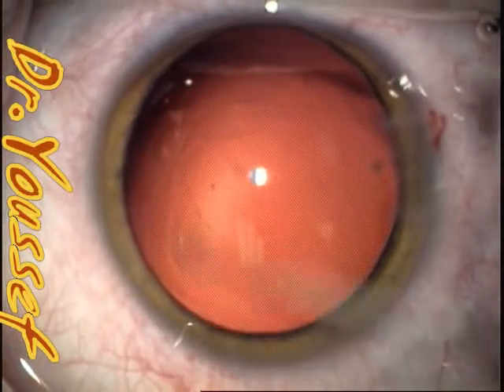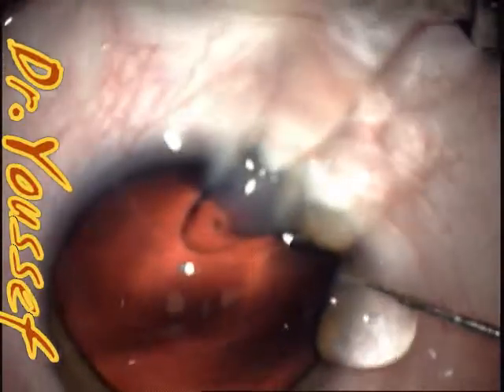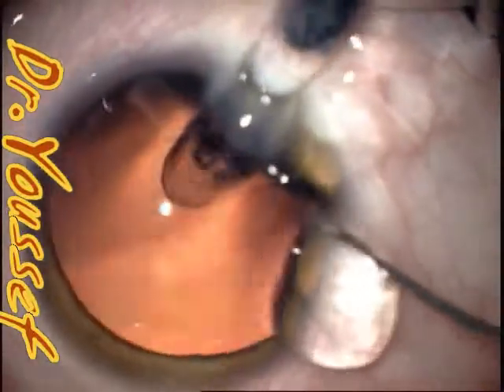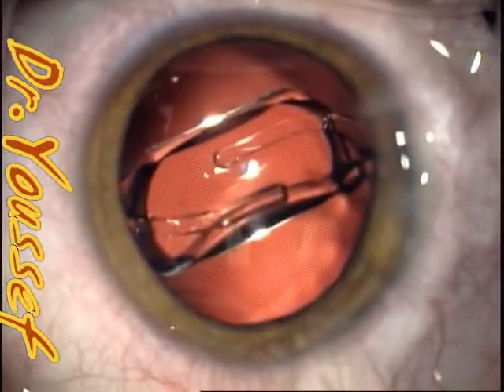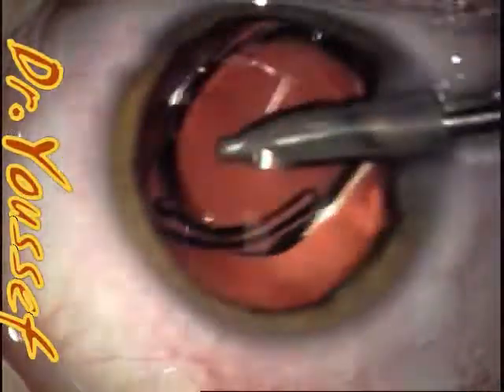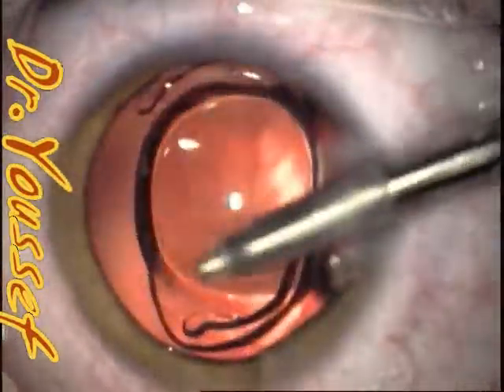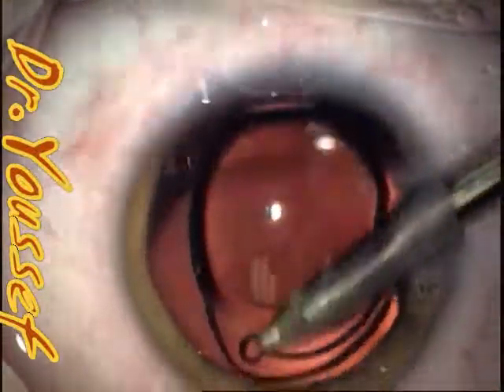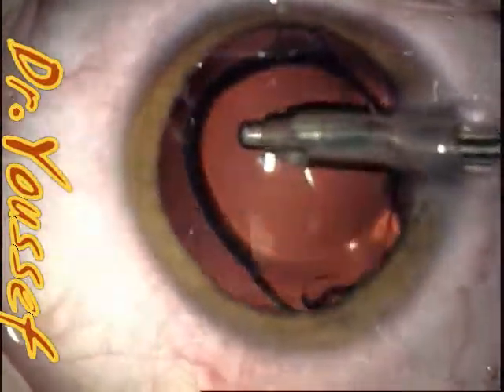The calculated intraocular lens was plus 36, or 35.5, so I implanted plus 34. This is the highest power available for this lens type. I didn't want to implant a lens with glistenings — the Acrysof SN60AT can go up to plus 40, but I don't like the glistenings and the quality of optics over time. It forms vacuoles inside the lens and affects contrast sensitivity long-term and visualization of the fundus. The AMO ZCB00 material is better; it has a nice optic edge and is an aspheric lens with front-surface aberration correction.